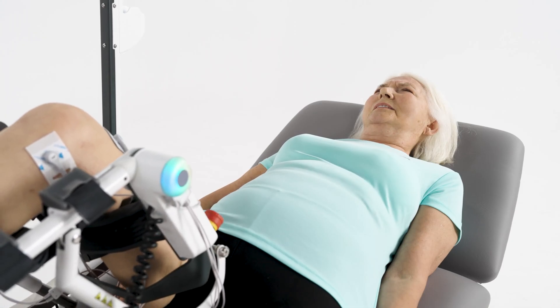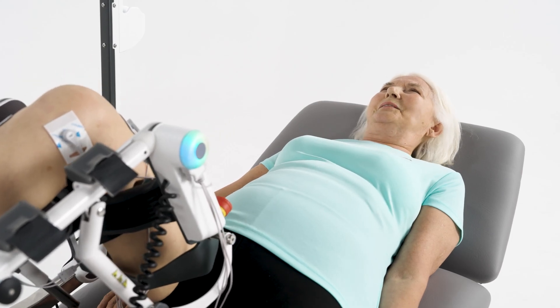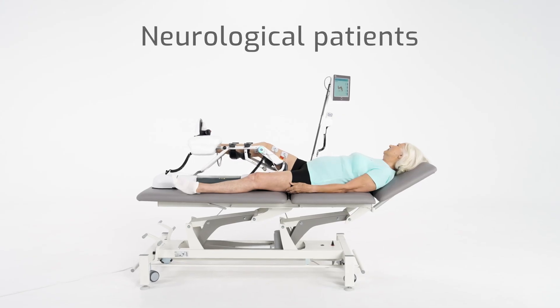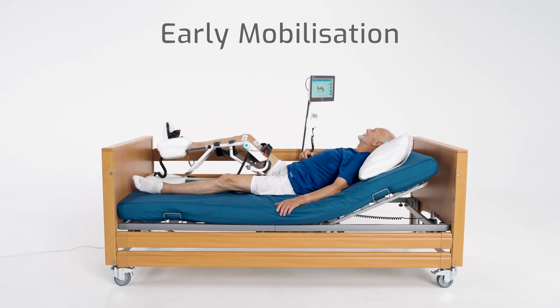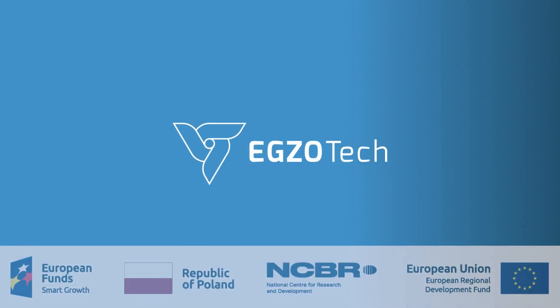Patients can also work actively through different types of resistance trainings. Use Sidra LEG in various stages and areas of rehabilitation. Visit egzotech.com to get more information.